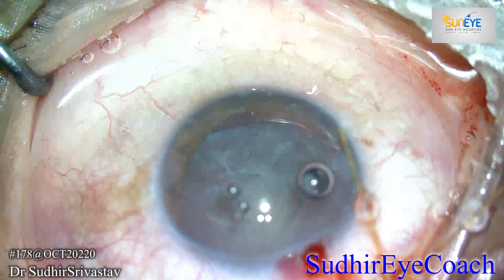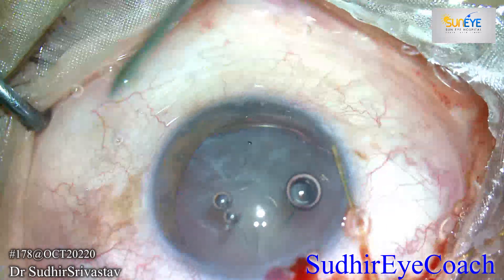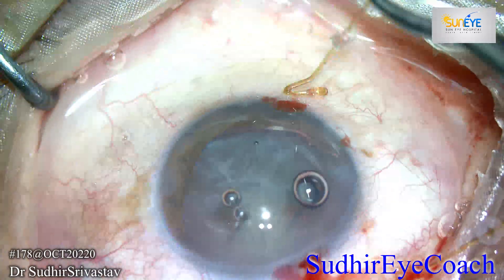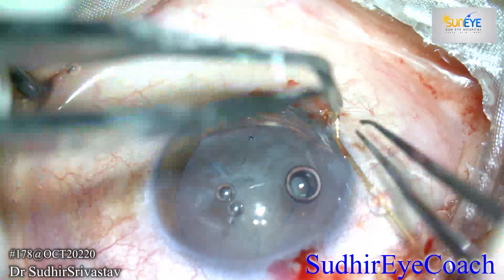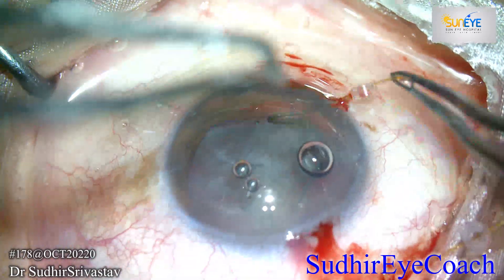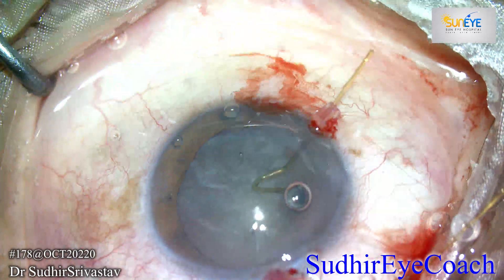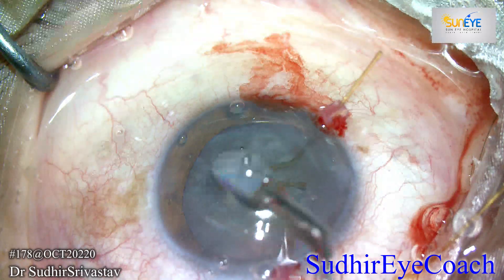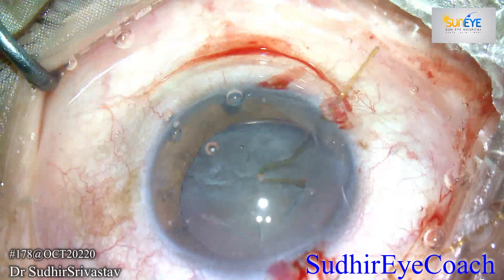I decided to go with two capsular hooks. I created two side-port incisions at the limbal area, then placed the capsular hooks inside the anterior chamber. Capsular hooks are slightly bigger than iris hooks and they have blunt tips at the edges so that they won't create any tear in the entire capsule.